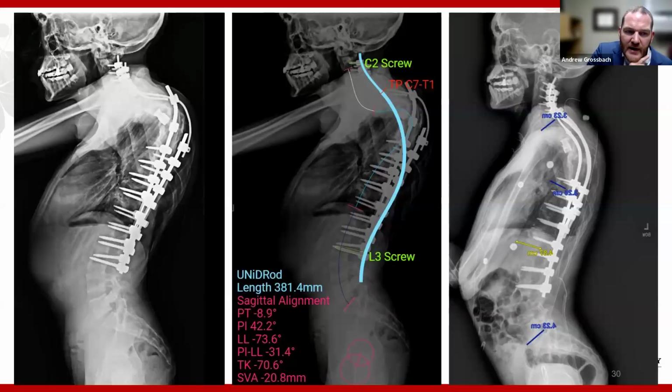So this is what we plan for him. So of course, going back in there and doing the same thing is probably not going to be successful. It's very difficult to bend a 5-5 rod to 90 degrees. One, it's hard to do, and two, you fatigue that metal a lot by overbending it. If you take a 3-5 rod and you have it bent 90 degrees, that's not a strong rod. It's failed multiple times now.